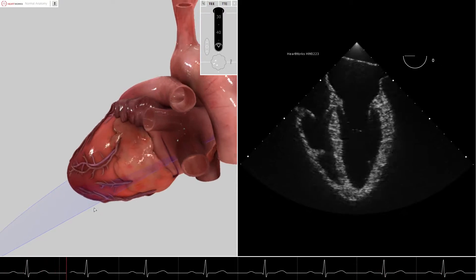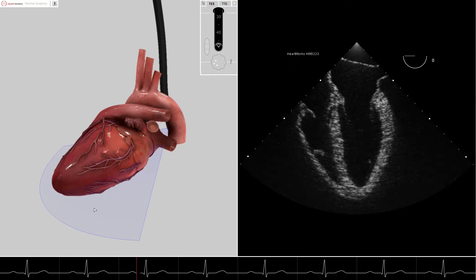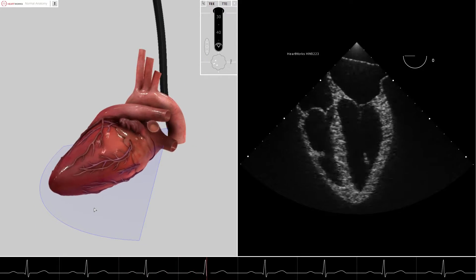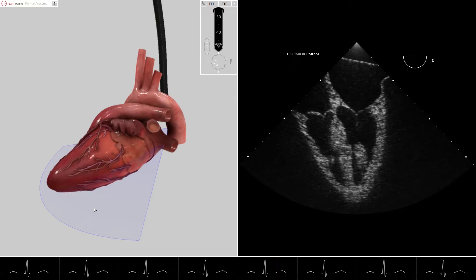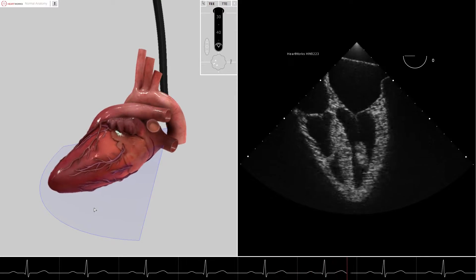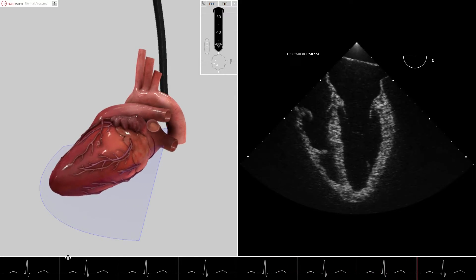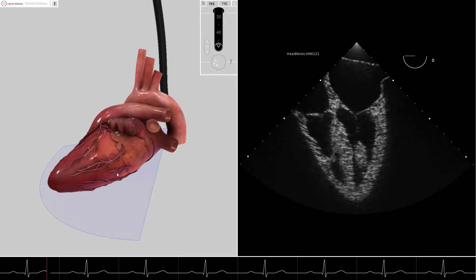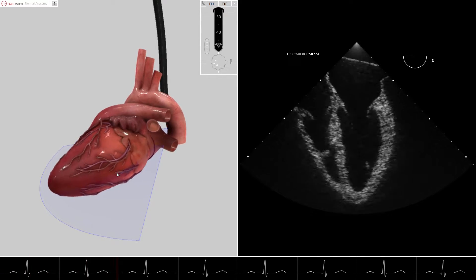To further clarify the position of the cut plane, we will zoom out of the VR image again. It should be noted that the zero-degree cut plane slices through the anterior lateral wall of the left ventricle.